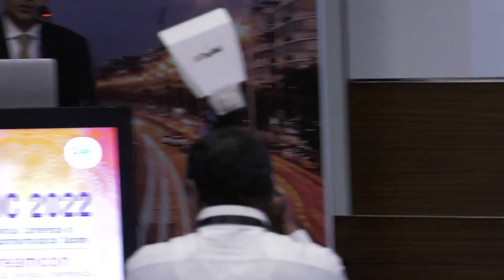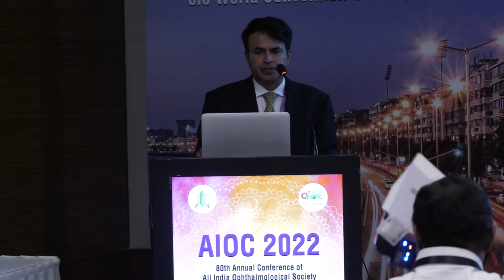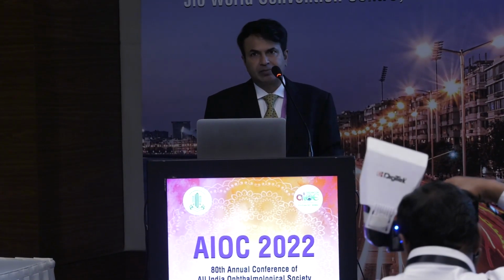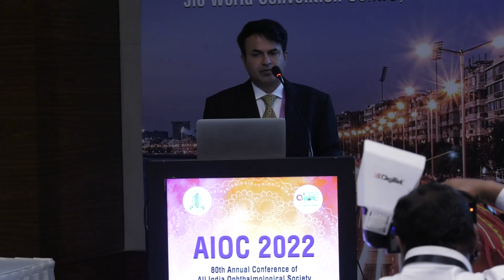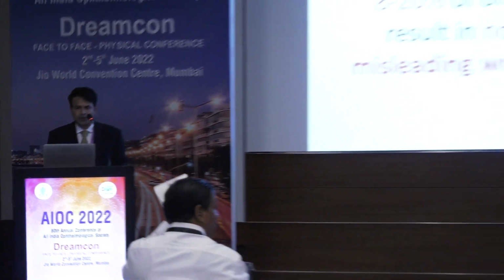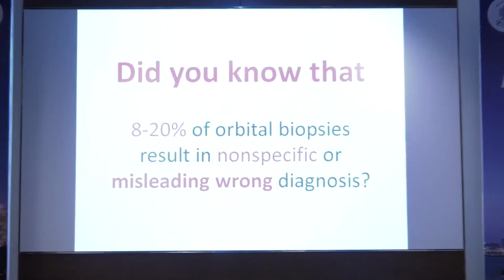I'll be talking about something very basic, how to do an orbital biopsy. Infiltrative tumors that are not amenable to complete excision are taken up for orbital biopsy, especially if excising a tumor would have a functional deficit. And this is what the literature says.